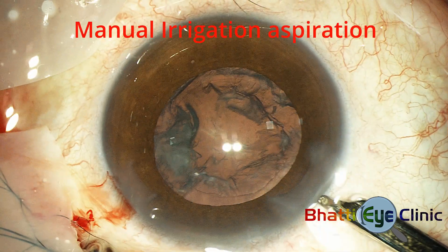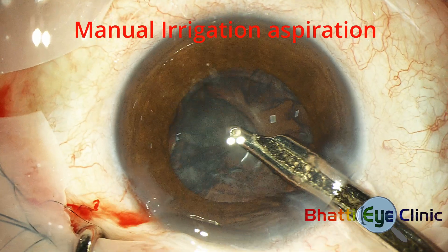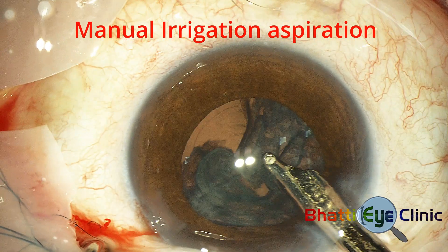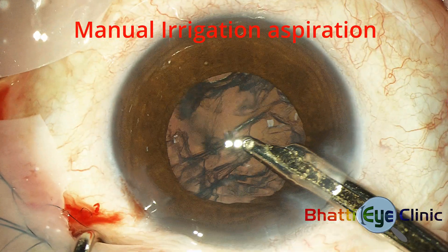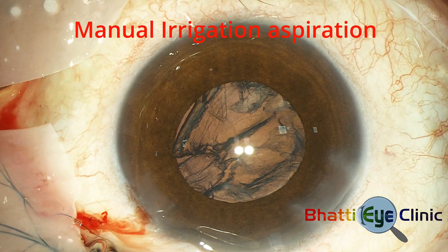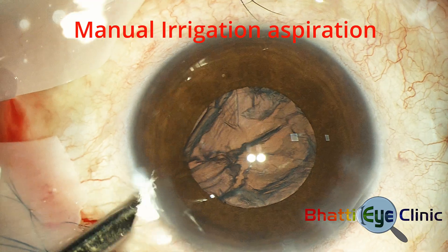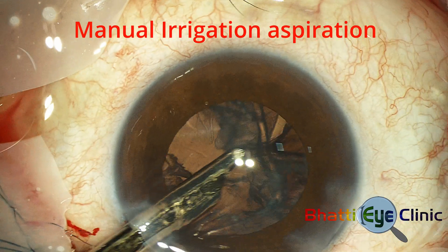Irrigation and aspiration is performed using a double-barreled Simcoe cannula. The suction being manual allows very good control of the aspiration. The method is to get a grip on the anterior cortex using low suction to bring it into the center, then increase suction to aspirate it or strip it away from the posterior capsule and remove it from the eye. Both ports can be used to access the cortex in different parts of the lens.